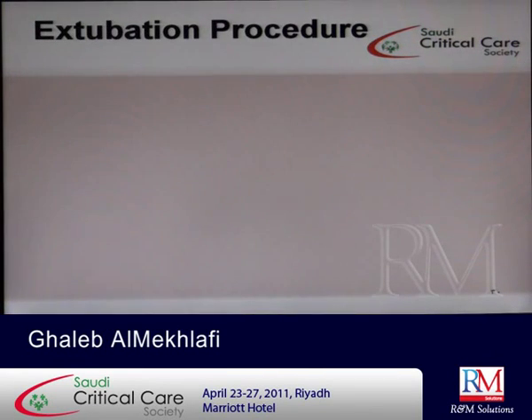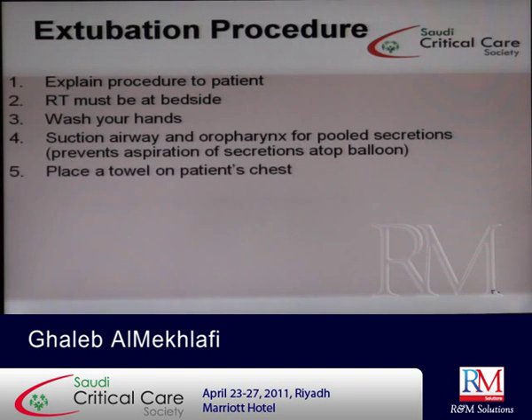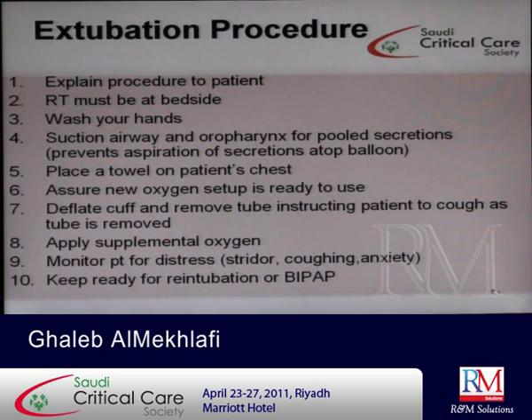Now finally, the patient is ready to wean, you did the spontaneous breathing trial, and the patient is okay, so you will do extubation. Of course, you have to follow the sequence: explain the procedure to the patient, RT must be at bedside, wash your hands, suction airways, place a towel on the patient, assure the new oxygen setup is ready to use, deflate the cuff, apply supplemental oxygen, monitor for distress, and keep ready for reintubation. Or in a patient who has COPD or pulmonary edema, you can use BiPAP directly after extubation.